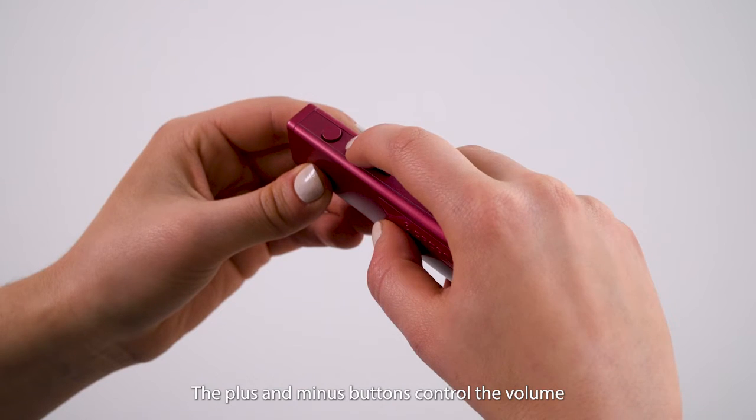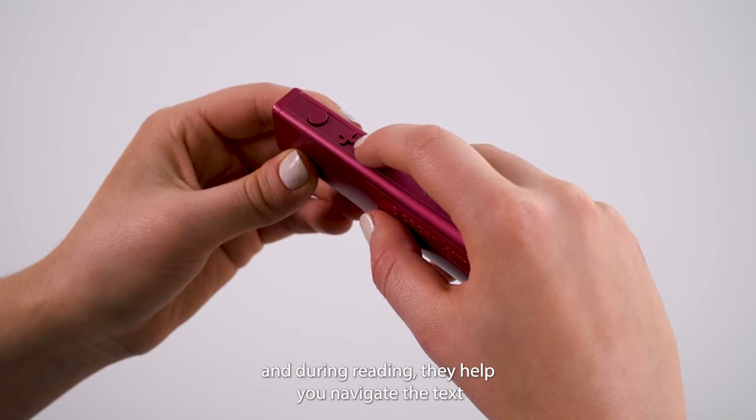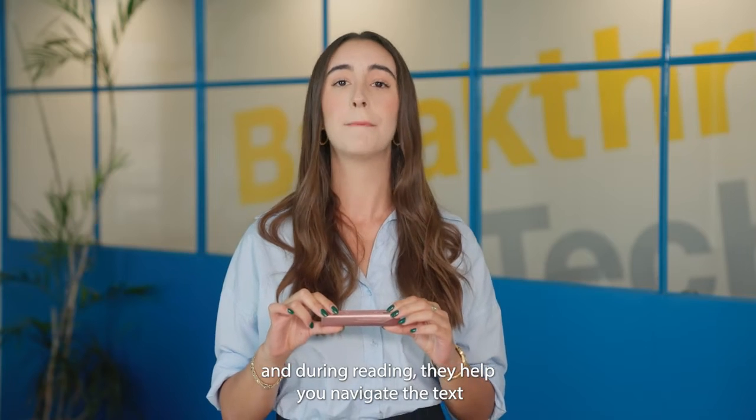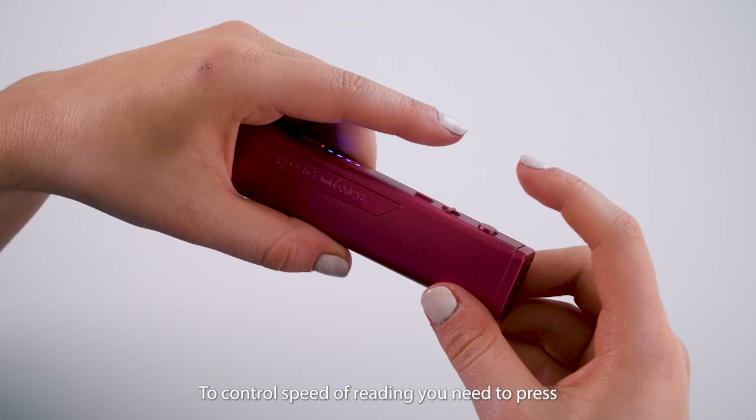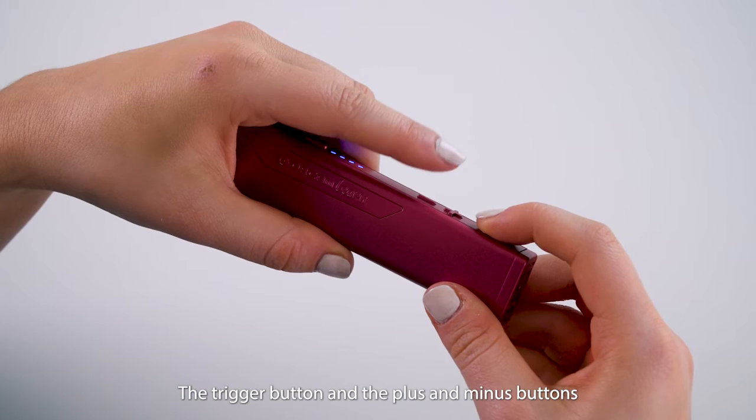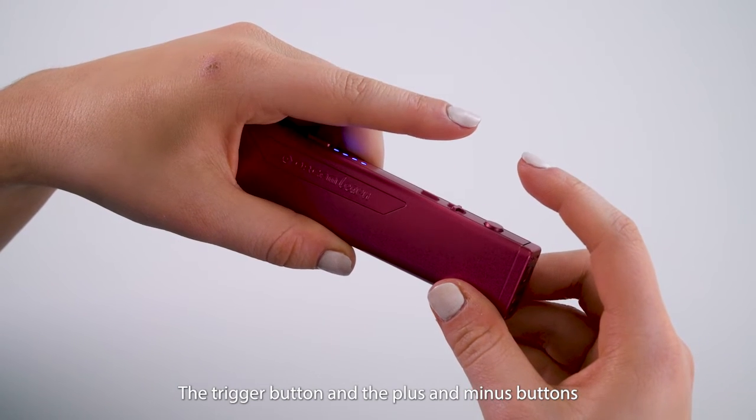The plus and minus buttons control the volume, and during reading they help you navigate the text by skipping back and forth between lines. To control the speed of reading, you need to press the trigger button and the plus or minus buttons.